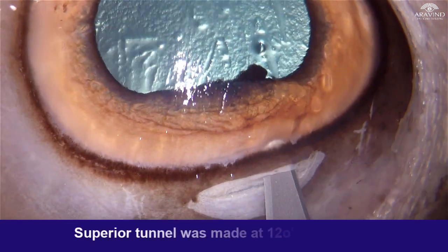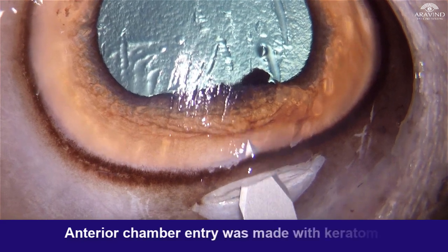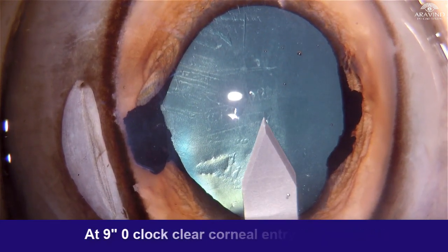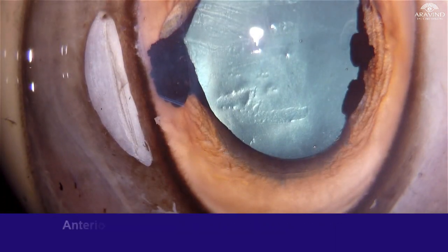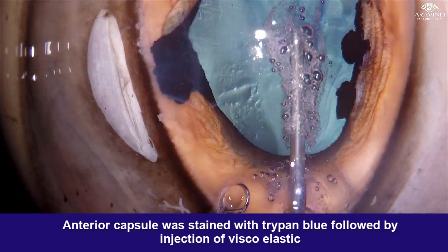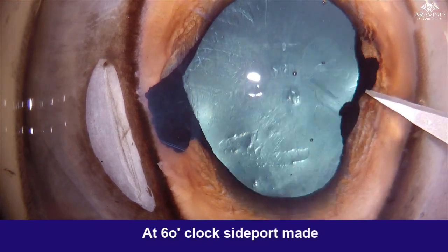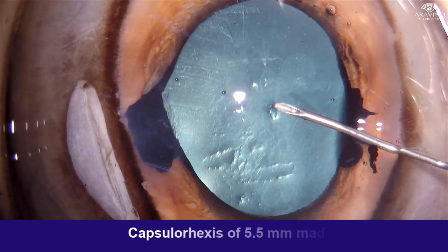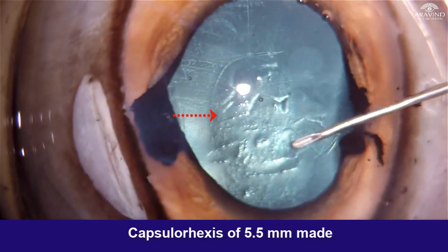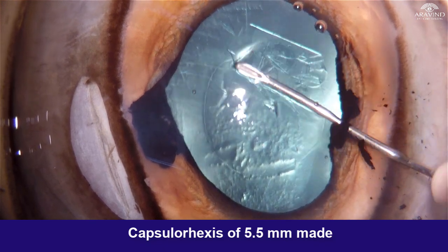A superior tunnel of 8 mm was made at 12 o'clock. Anterior chamber entry with a keratome was made. At 9 o'clock a clear corneal entry was made, followed by staining the anterior capsule with Trypan blue, and then viscoelastic was injected. A 6 o'clock position side port was made depending upon the comfort of the trainee.